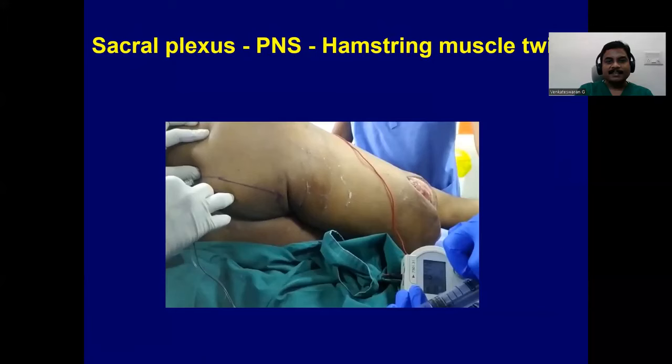So these are all the challenges when there is no foot or leg. How will you look for the motor response? Always go slightly proximal to your expected motor response in these types of challenging situations for a good lumbar and sacral plexus block.